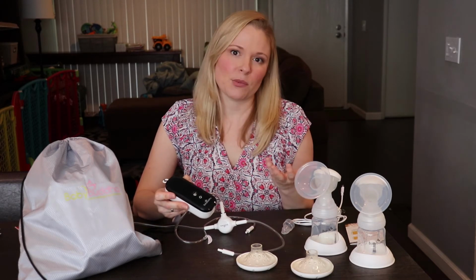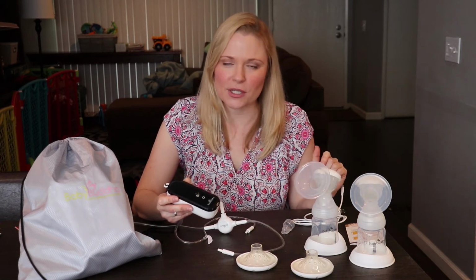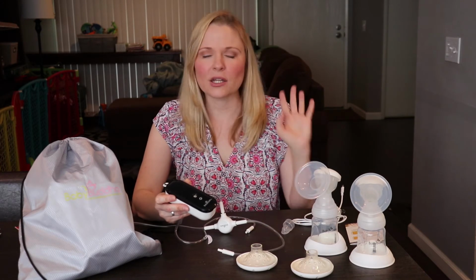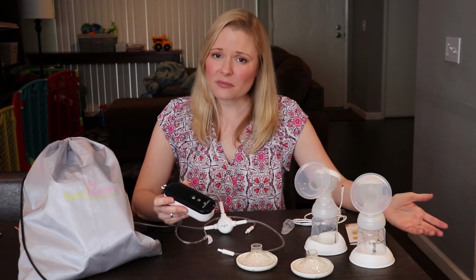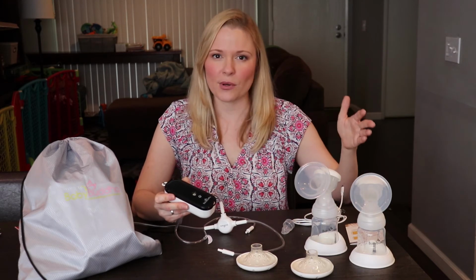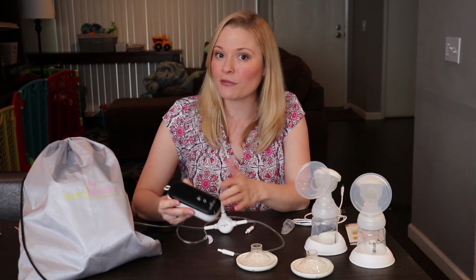And now there are enough people out there who have a Buddha and they've talked about what numbers they use. Like I was on number 3 for a very long time, and then I would go back and forth from suction to letdown mode, like in the middle. Anyway, I digress. I feel like with some of the other more established providers of breast pumps, they can tell you right down to the minute and the numbers, and you can follow that formula and it's smooth sailing. Whereas this, I feel like there's just a little bit more tinkering involved.